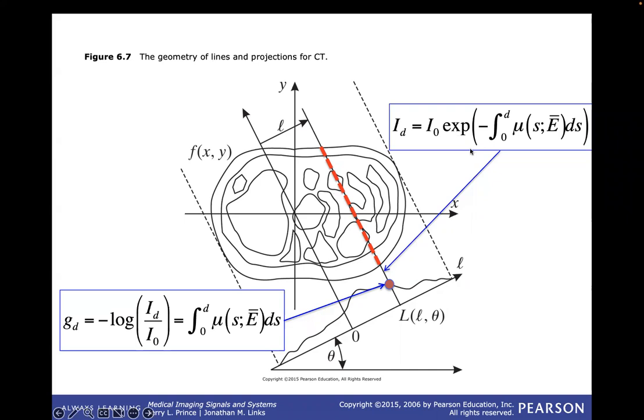But essentially, in CT, when you're doing reconstruction, if you have X-rays entering the body, you have I0 X-rays, like a flux that is so many X-rays per second, and they're coming into the body here, and you ask, well, how many make it through to this point? It's proportional to how many you put in times an attenuation factor. Right? There's going to be fewer photons come out here than went in.